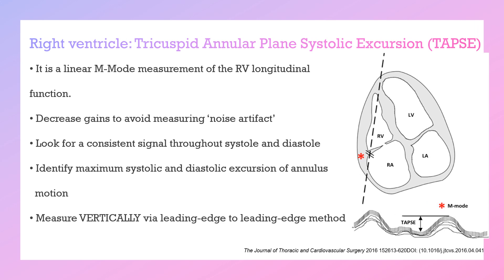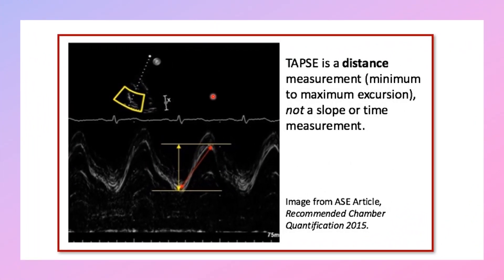For right ventricular function, we measure tricuspid annular plane systolic excursion (TAPSE), a linear M-mode measurement of RV longitudinal function. Place the cursor on the lateral wall of the tricuspid valve annulus, decrease the gain to avoid noise artifacts, and look for constant signals throughout systole and diastole. Identify maximum systolic and diastolic excursion of the annulus motion and measure vertically via the leading-edge-to-leading-edge method. TAPSE is the distance measurement between minimum and maximum excursion — a distance, not a slope or time measurement.